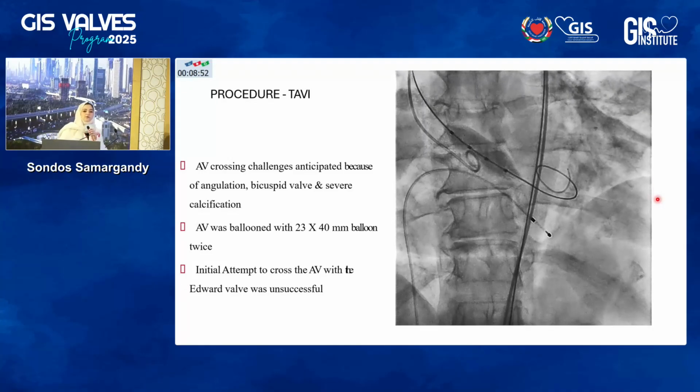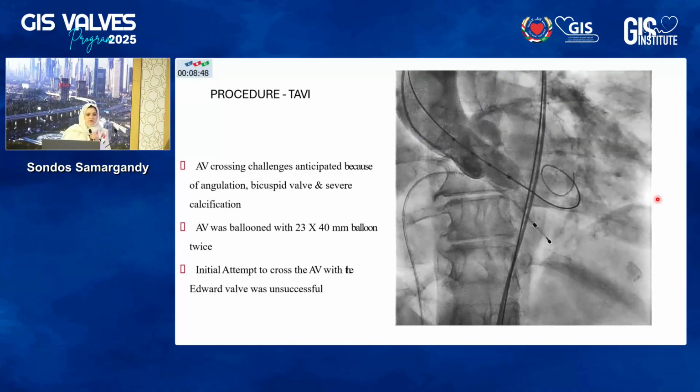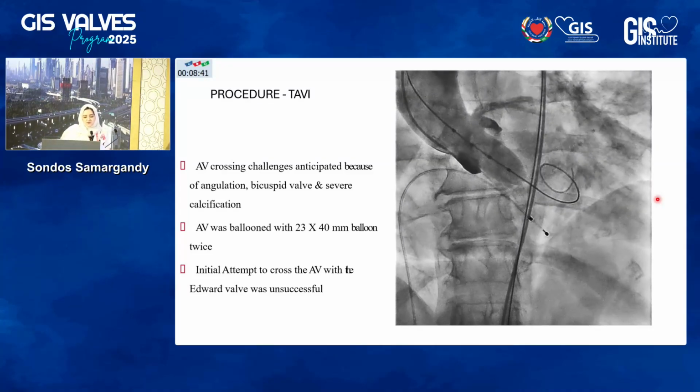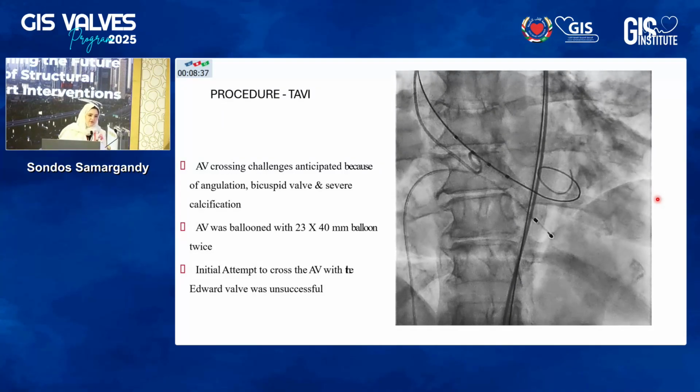Okay. Dr. Faisal Al-Goufi, I also would like to hear your take. In terms of your balloon size choice, do you go for the minimal diameter, or something in the middle, knowing this is a case of 26, knowing the sizes? Which balloon are you going to go with as a first take?